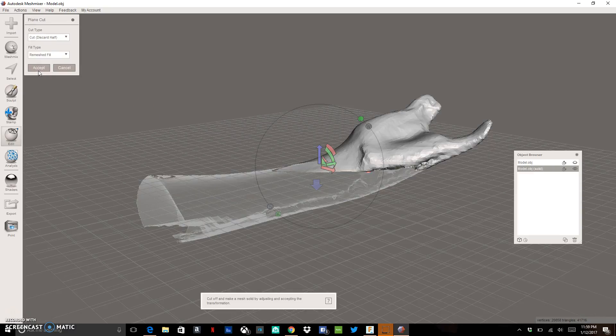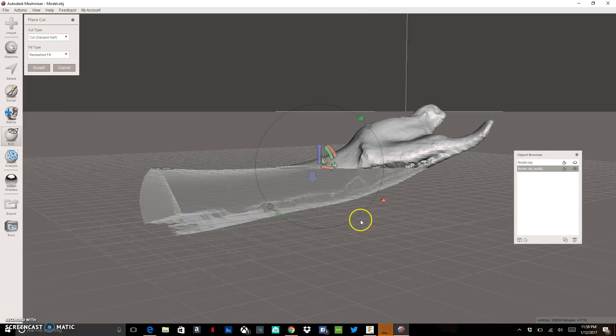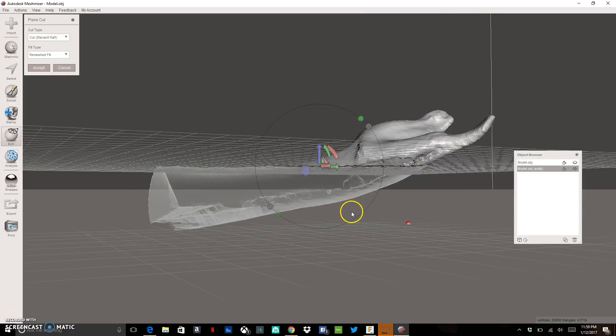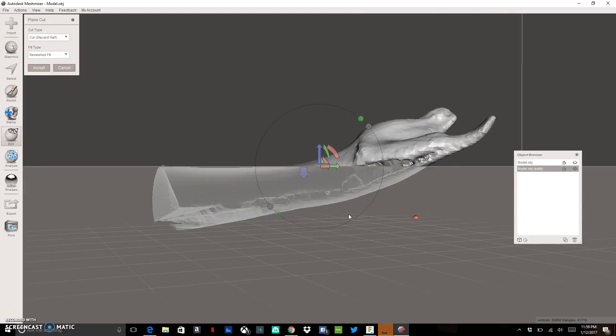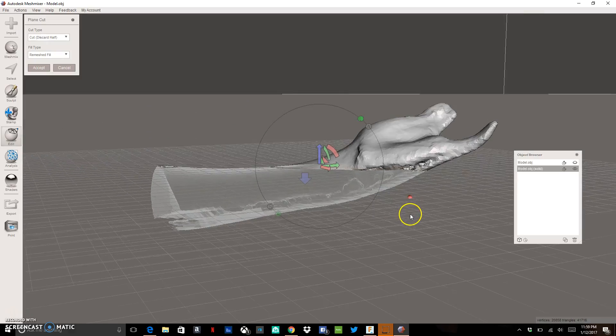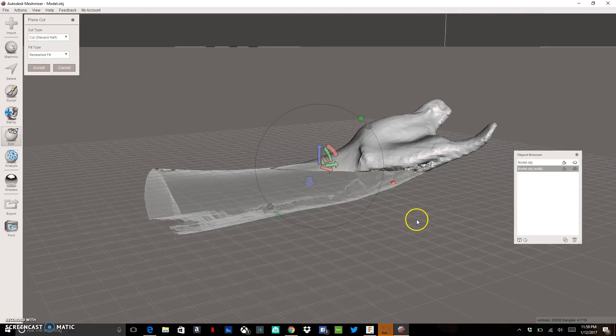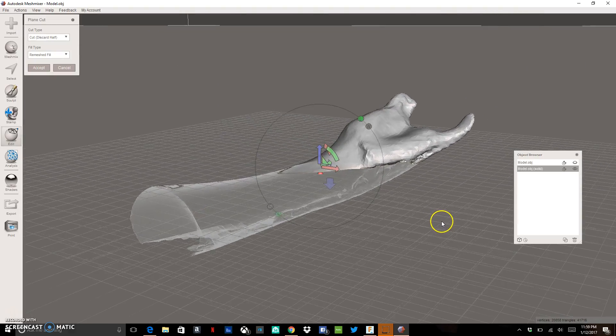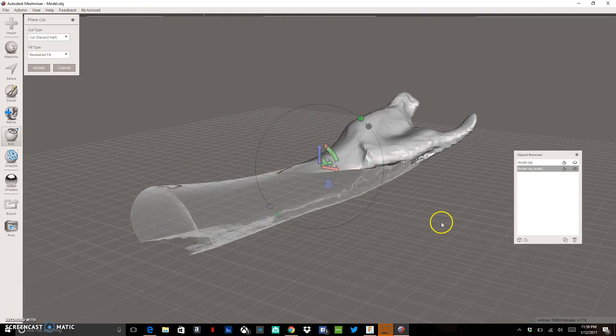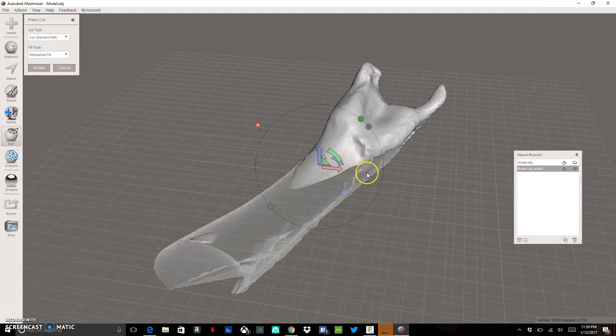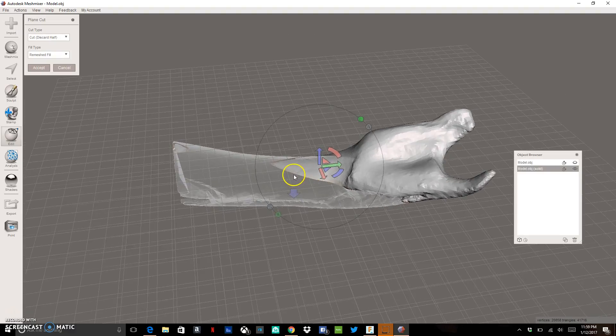So I can go to this plane cut and I can see that it kind of draws this line, draws this plane. And anything beneath this plane is kind of this ghost color. This ghostly color means it's going to be cut out of my model. And I can change the orientation of this plane using these little different colored circles and arrows.